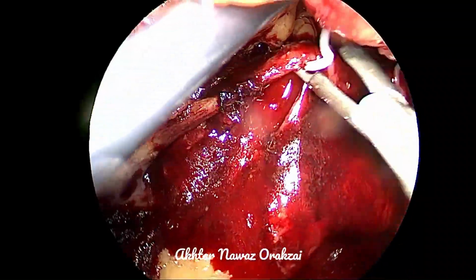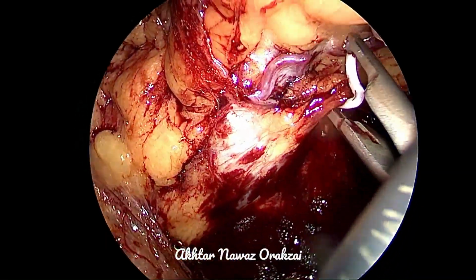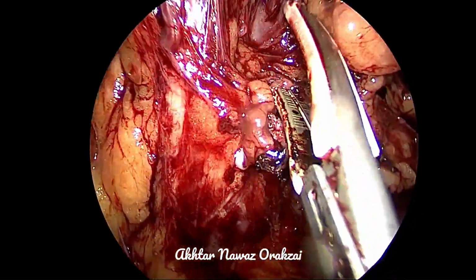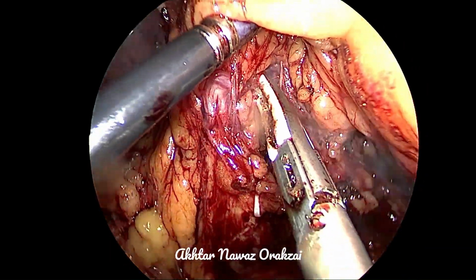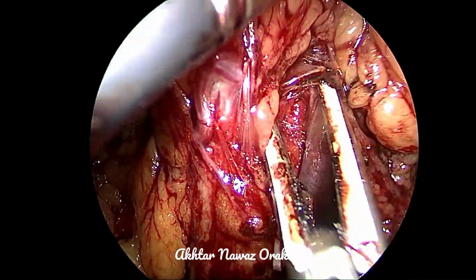We encountered a small bleeding vessel in the periaortic lymphatic tissue, or it may be one side of the gonadal vein. So that has been clipped and the area has been cleaned. Now we are moving towards the dissection of the pedicle.